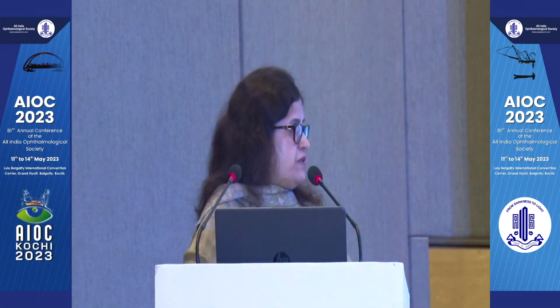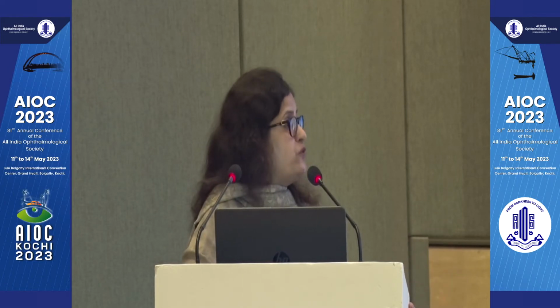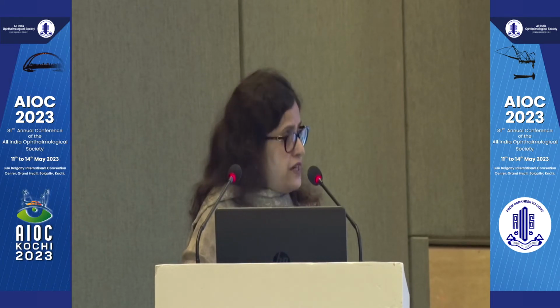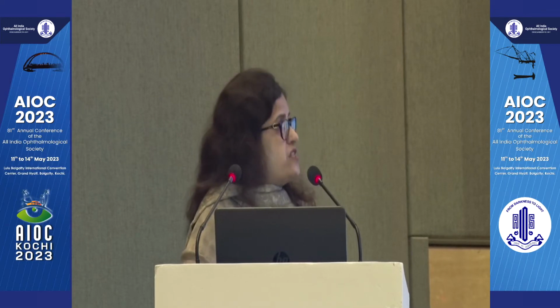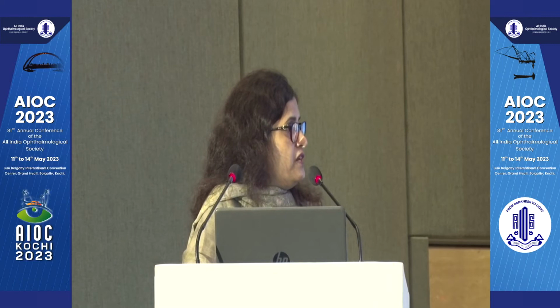Because I started with the handle one, the Swan Jacob type, I'm very used to that, and you can keep rotating the lens, although it is not a very wide field lens, as now we have disposable lenses which are wide field. They cover almost the entire cornea, and the magnification is pretty good with the Katena lens and the SX lens. But the Swan Jacob, which is of vogue, you don't get so magnified a view unless you increase the magnification of the microscope. That can be uncomfortable, especially for the beginner, to operate under such high magnification. But over a period of time, I think one gets used to it.